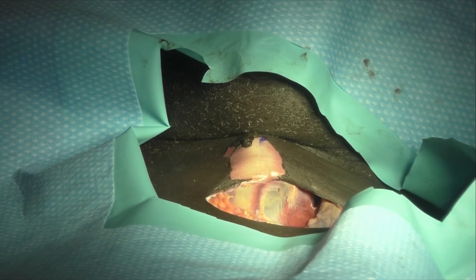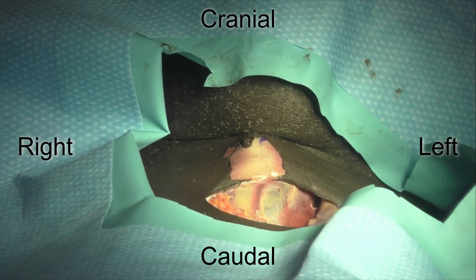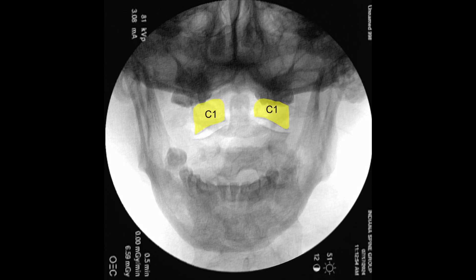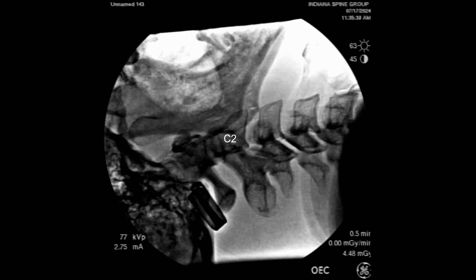As you can see, we have the specimen in the supine position. Cranially is at the top of the screen, and the chest is at the bottom. We have biplanar fluoroscopy with the mouth opened using bite blocks so we can see an appropriate odontoid. We're going to start by showing the AP x-ray. You can see we have good visualization of an open-mouth odontoid shot, and after adjusting for perfect rotation, the lateral masses of C1 are evenly spaced and the tip of the odontoid is visible.